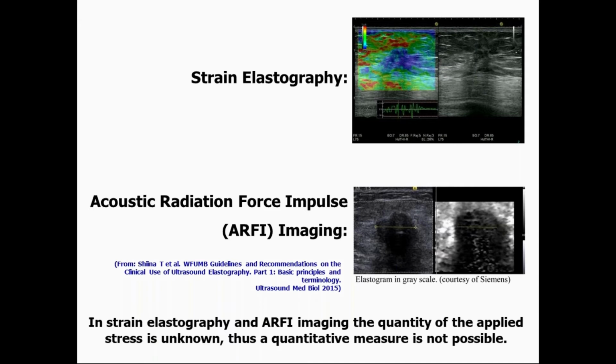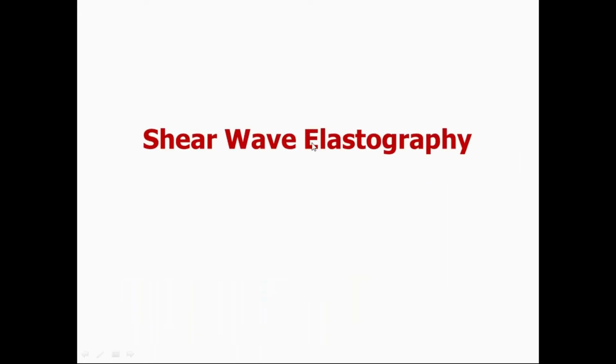These are qualitative images, and indices can also be obtained. However, in strain elastography and ARFI imaging, the quantity of the stress is unknown. Thus, it is not possible to obtain a quantitative measure of the stiffness.